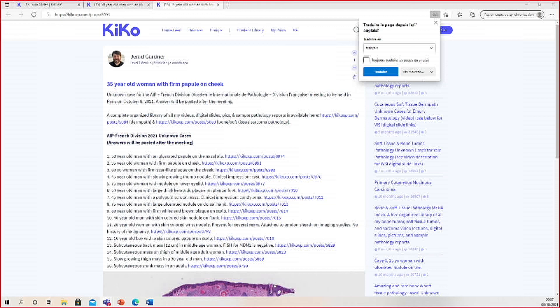Practically, the immunostains I find most useful are very binary: strong and diffuse is positive; anything less is negative. Unfortunately, many immunostains are not that way. The struggle is real — no matter how long you do this, it's still hard. I keep telling my fellows and residents that I thought dermatopathology would get easy one day, but that day has not happened yet.